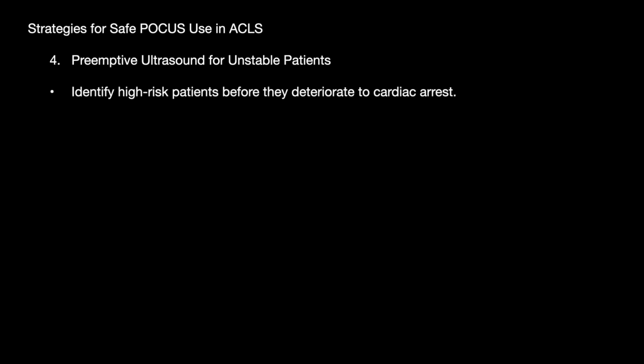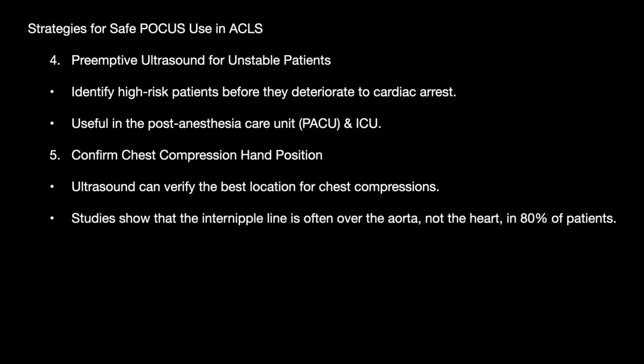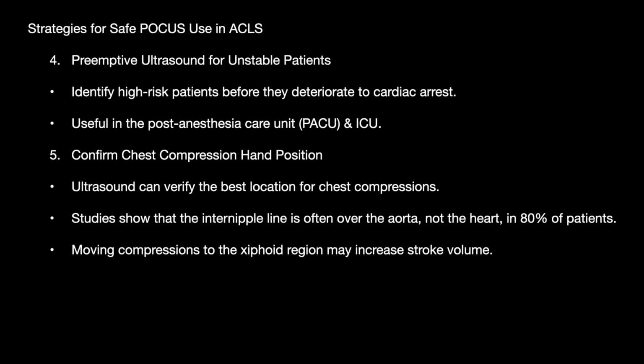Now, the next thing is preemptive ultrasound for unstable patients. If your patient is very unstable and high risk, you can do the ultrasound beforehand. It is useful in the post cardiac arrest and post anesthesia care units. The chest compression hand position can be confirmed by ultrasound, and studies show that the internipple line is often over the aorta and not the heart in 80% of cases. Moving compression to the xiphoid region may increase stroke volume.